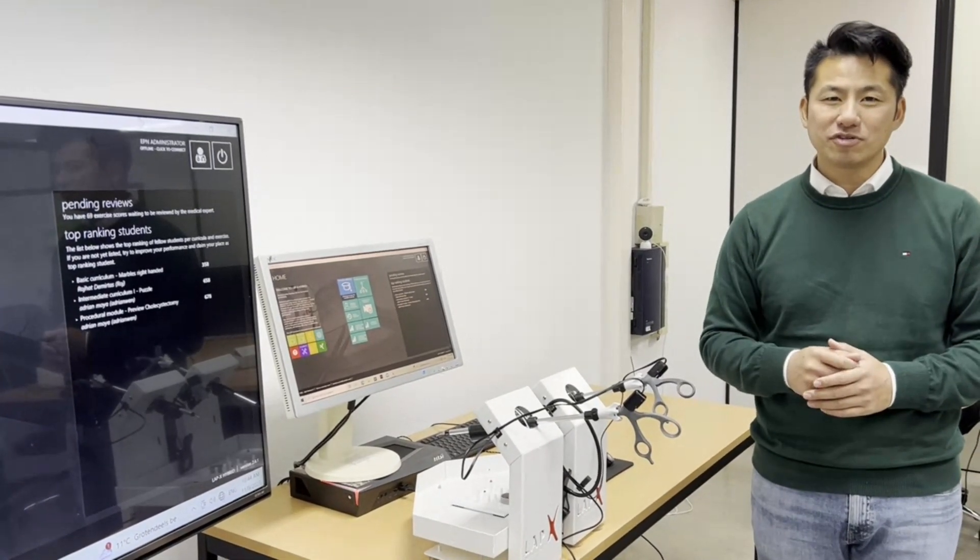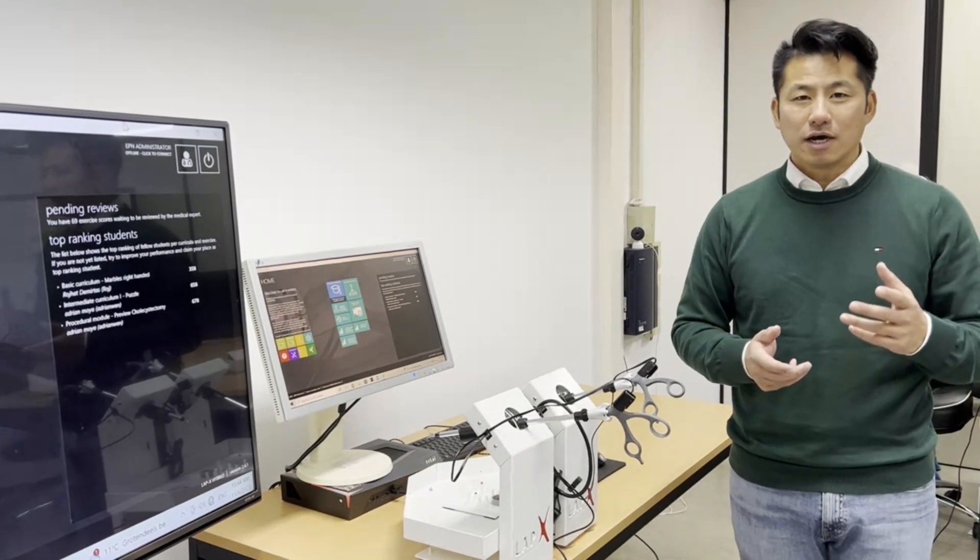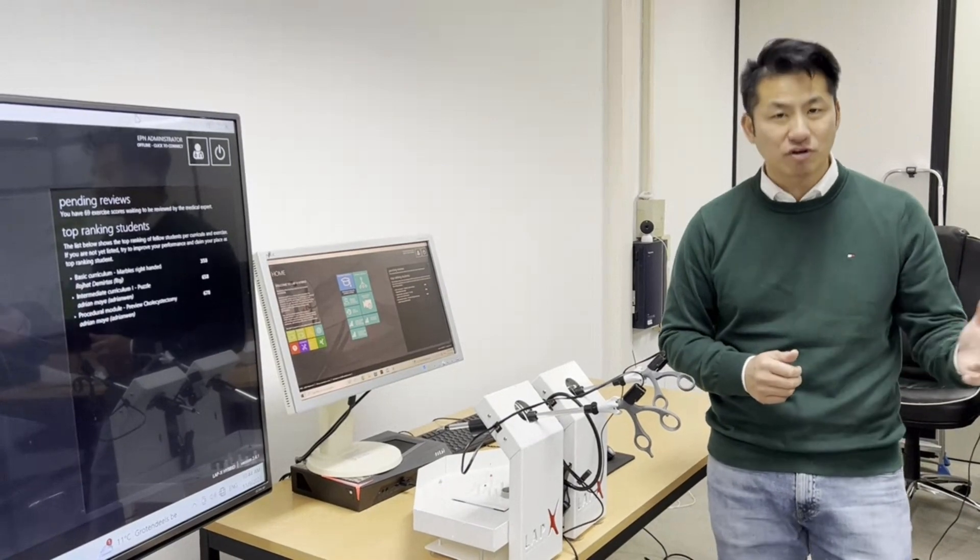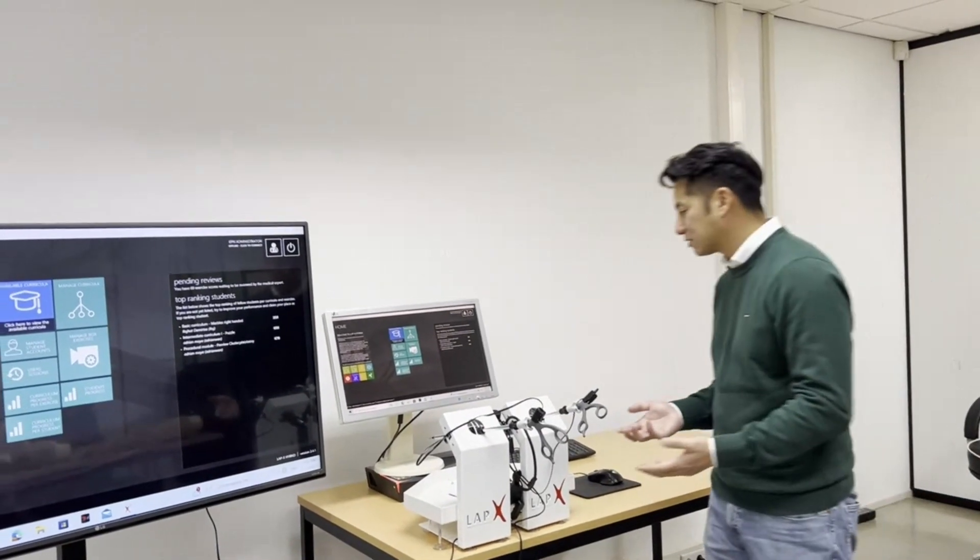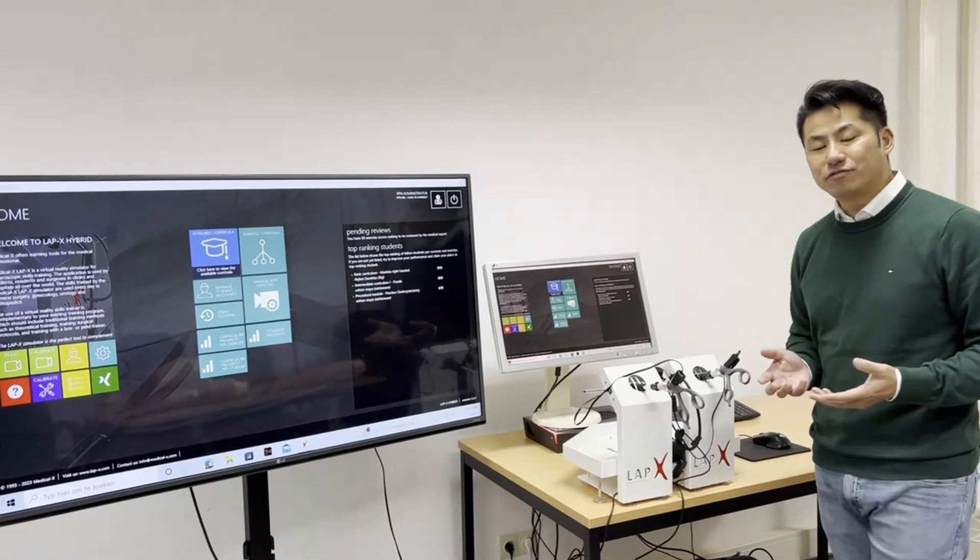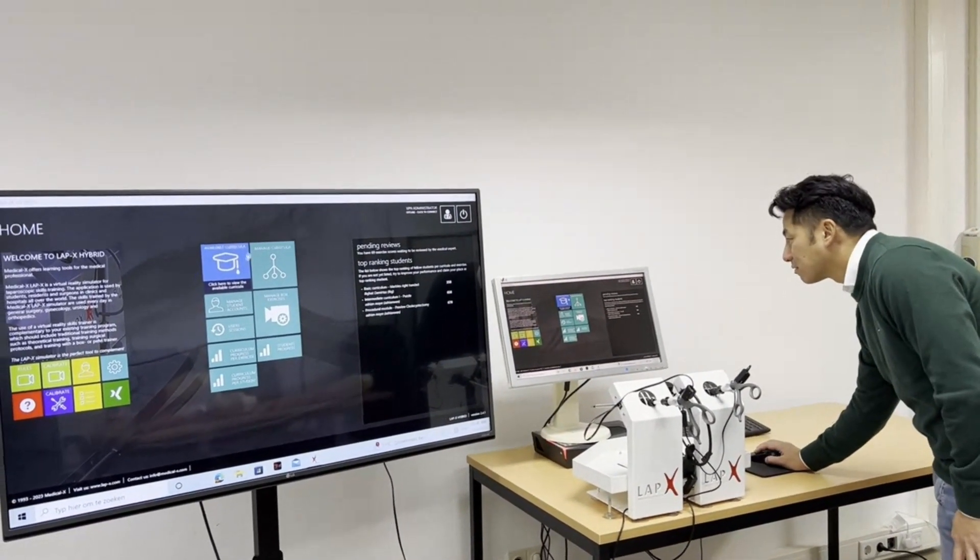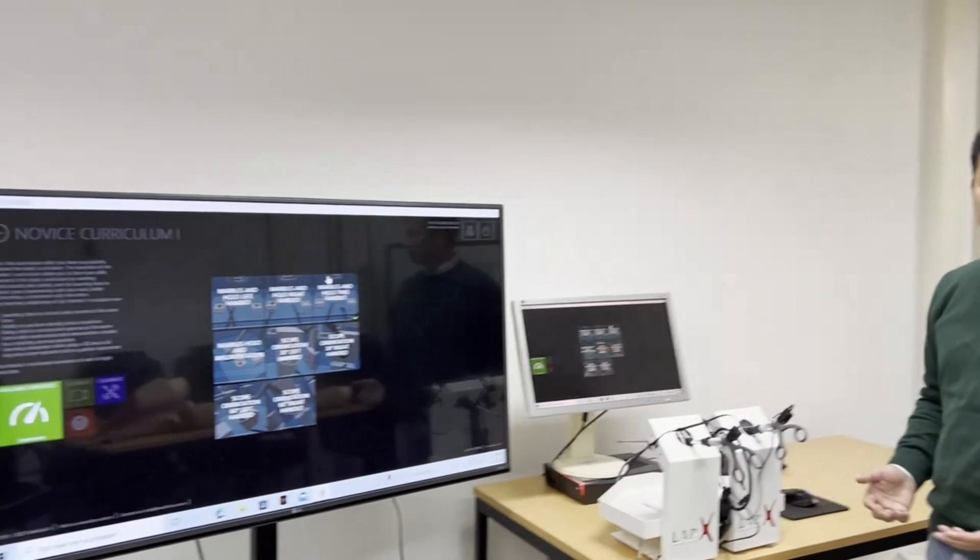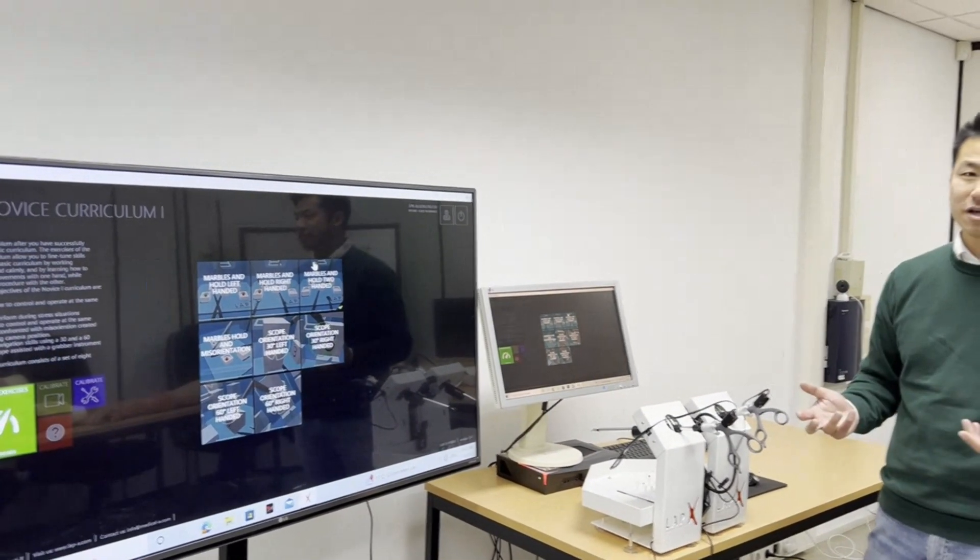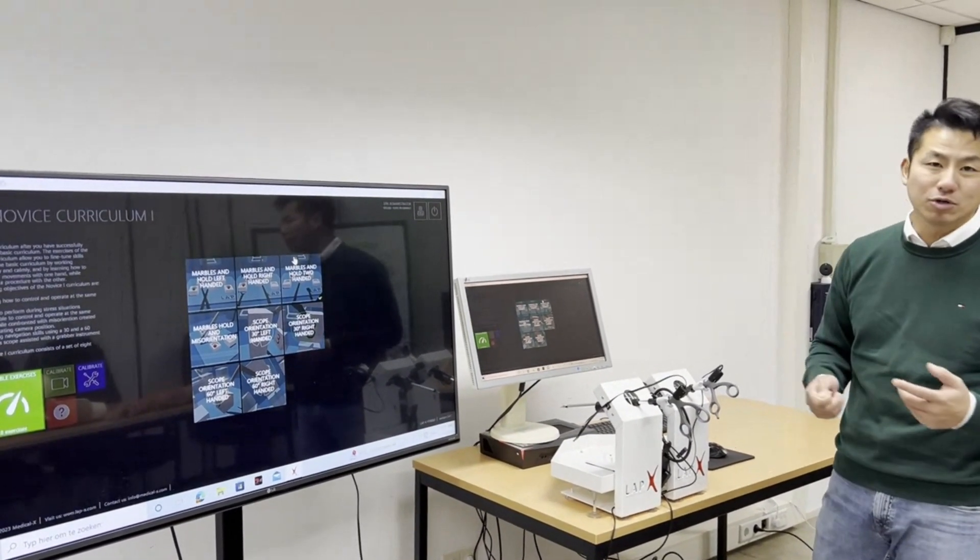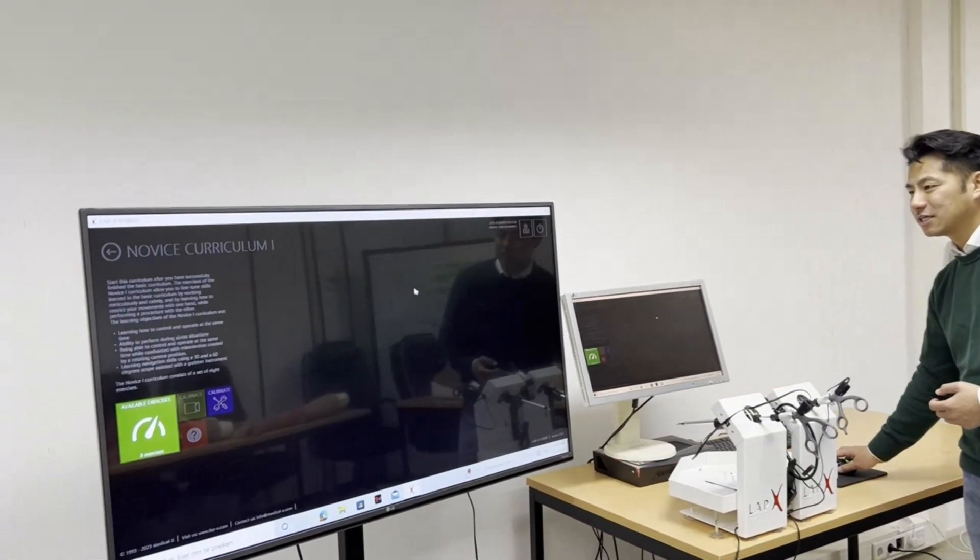There is one more difference between the LAP X box exercises and the LAP X hybrid box exercises: with the LAP X hybrid you can also record some parameters that the LAP X box doesn't record. For example the path length of the instruments you can record with the LAP X hybrid in the box training mode and the LAP X box does not have that function. How do you train? It's quite a straightforward simulator so when you want to train a virtual reality exercise you just select an exercise. Let me open one exercise as an example.